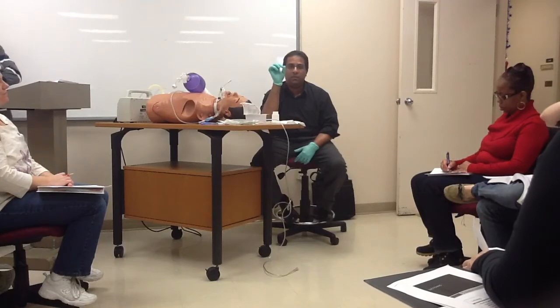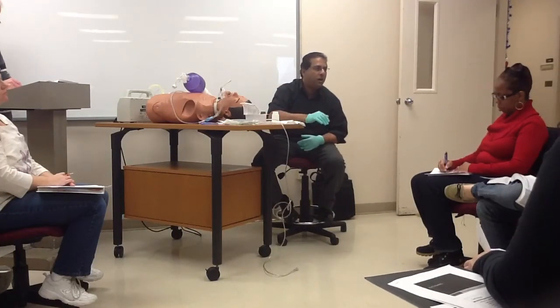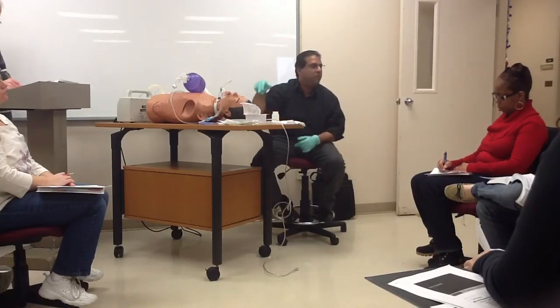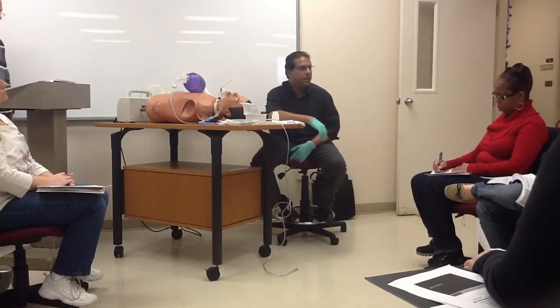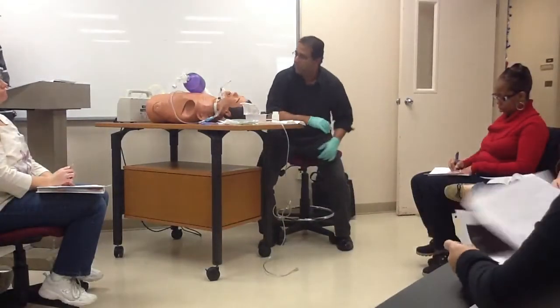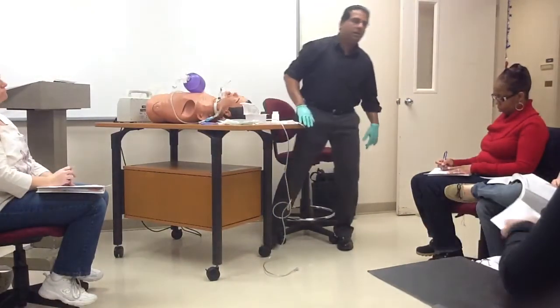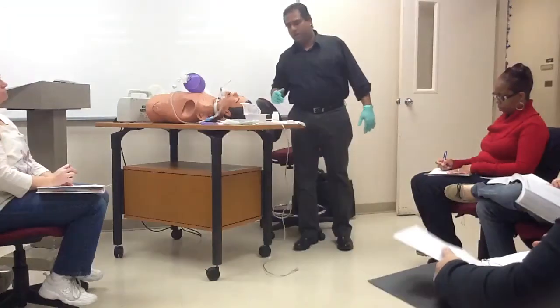This is extremely important. You have to pay attention to it because when you come to the hospital, you know how many thousand times I go in a patient room, they have a number 4 trach in, and they have a 14 French suction catheter sitting there, and nurses are suctioning them with the 14 French suction catheter. And the patient is bleeding. Probably hypoxic. They're sticking a huge suction catheter down the airway, and they can't even breathe, and it's hurting them. So that's extremely important.